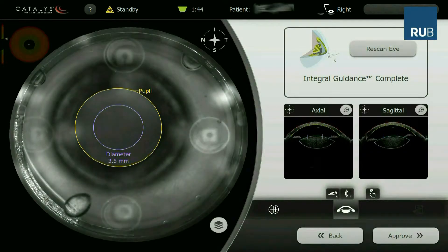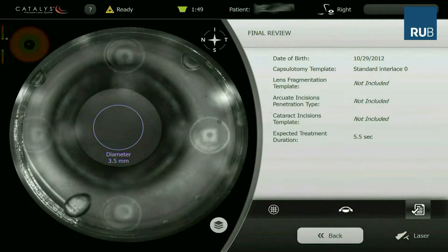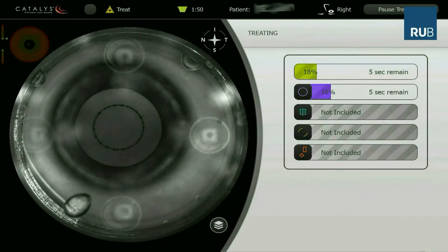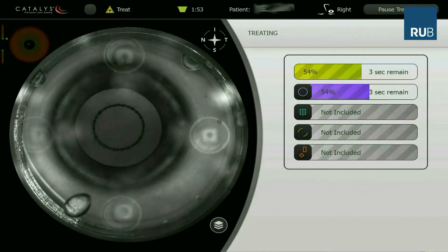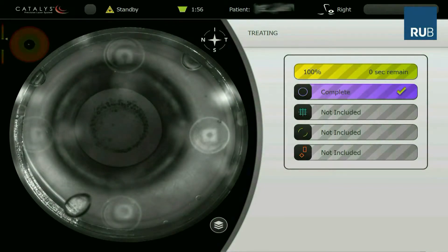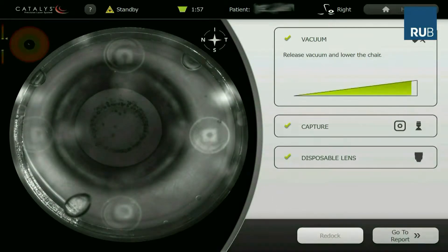The treatment time is 5.5 seconds. A lateral movement of the capsule reflects the high elasticity of the paediatric capsule. We implement a correction factor depending on the age to achieve an optimal capsulotomy diameter.